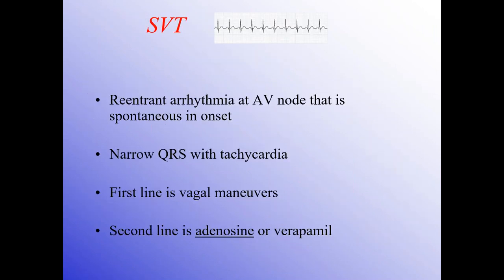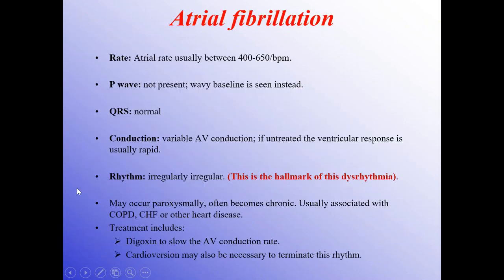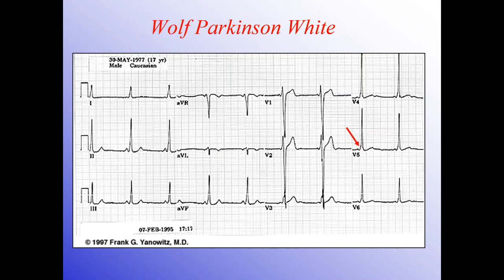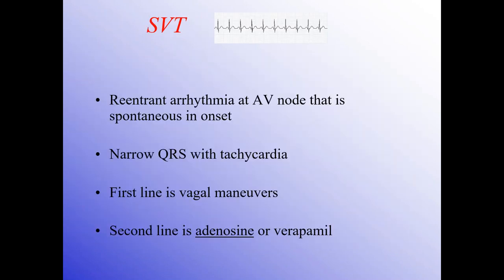Now, at the same time, understand this ECG. Though a small one, but understand this ECG. The WPW ECG is a very clear ECG. The other ECG is this ECG, understand? Here there is a tachycardia. It is totally regular. There is no widened QRS, but see, there is no P wave which you can appreciate, but it's totally regular. So it cannot be a flutter where you have a sawtooth P wave. It cannot be a fibrillation where you have a clear-cut irregularity. It's regular. So here the P waves are buried inside the QRS somewhere or in this whole system.